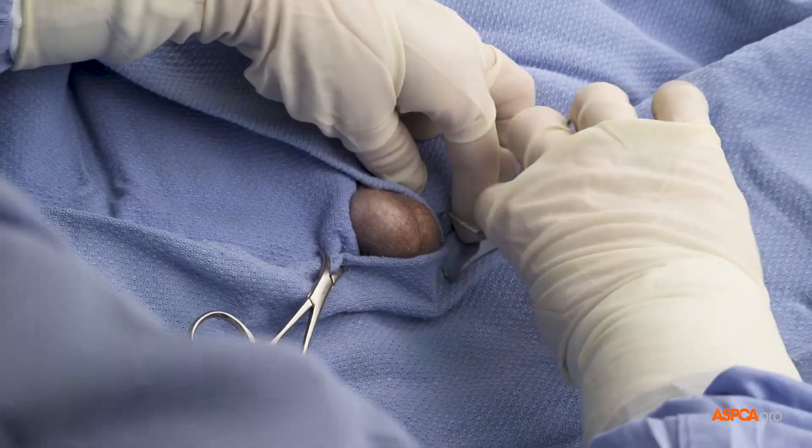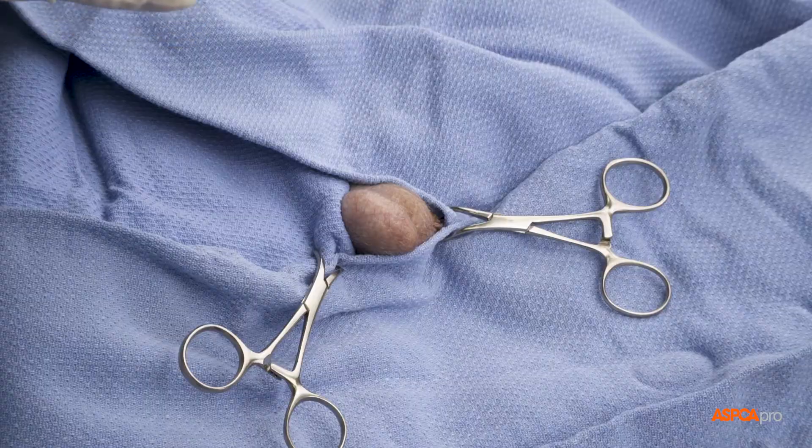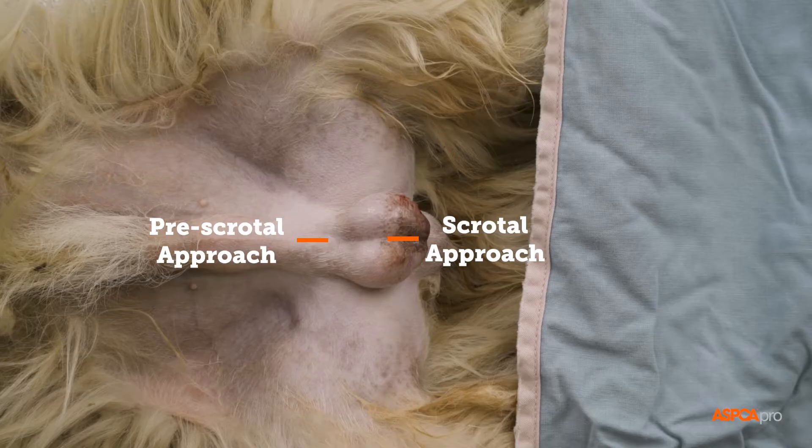Neutering a dog means removing his testicles. Here we demonstrate the scrotal neuter technique, which historically was thought to lead to self-mutilation. However, studies have shown that there is no greater risk of this compared to the traditional pre-scrotal approach.